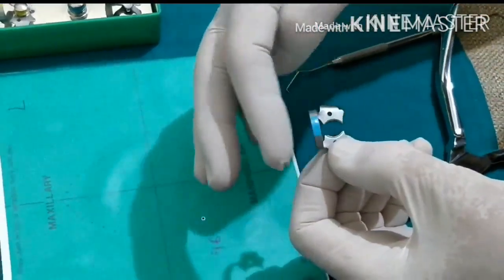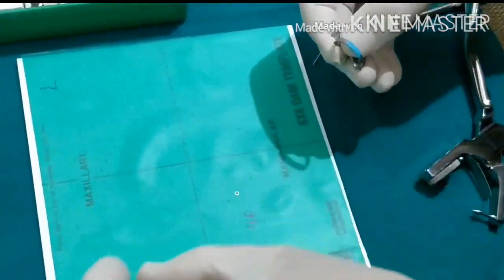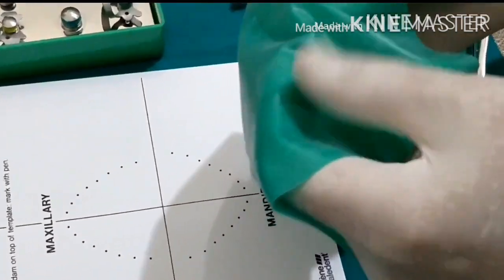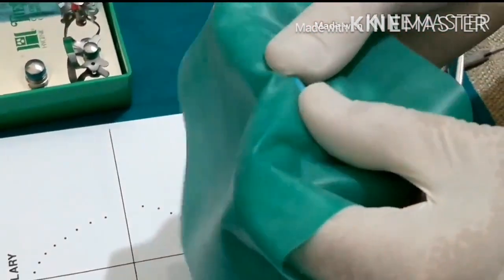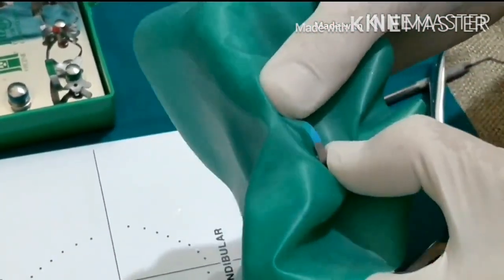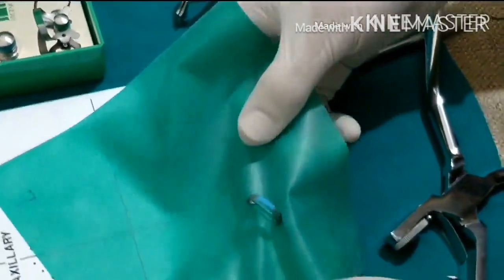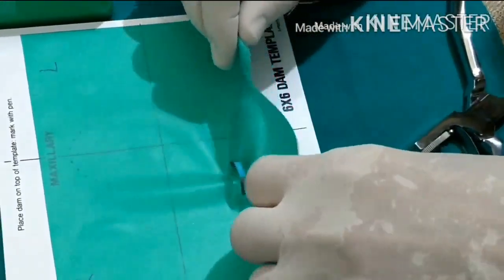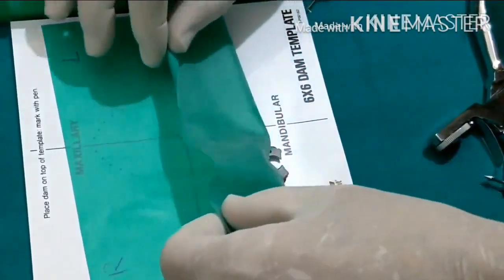We've punched for tooth number 46. Now we pick up the rubber dam clamp, making sure the horizontal bar is always towards the back — the distal side of the tooth. Then place the clamp in the center of the punched hole, hold the sheet with one hand, and slip the hole over the horizontal bar on one side then the other. The rubber dam sheet is then folded up so you can see the two holes clearly.